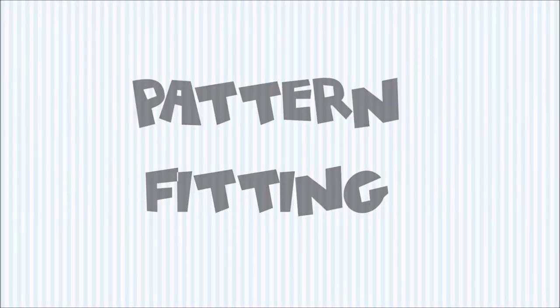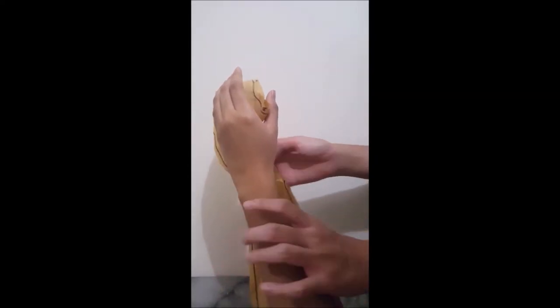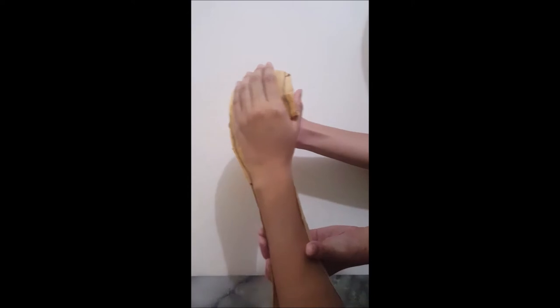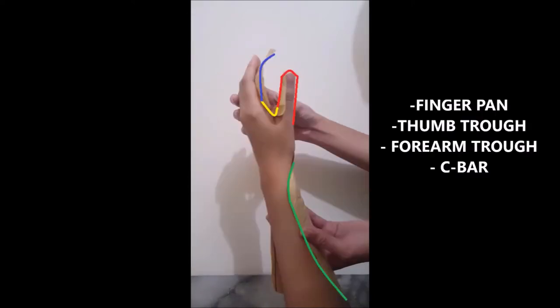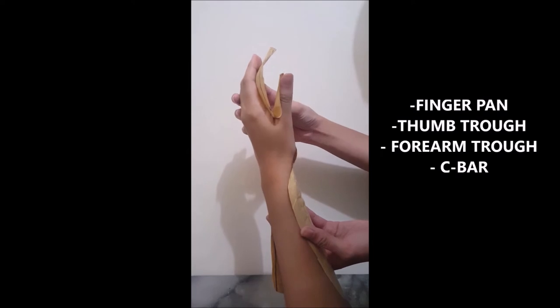Pattern fitting: Instruct the patient to rest the elbow on the table. The arm should be vertical and hand relaxed. You may also position the patient with forearm pronated or with forearm supinated. Cut out the pattern and fit it to the appropriate joint placement. Remember to check the four areas: the length of the finger pan, the thumb trough, the forearm trough, and the fit of the C bar. Make necessary adjustments on the pattern if needed.